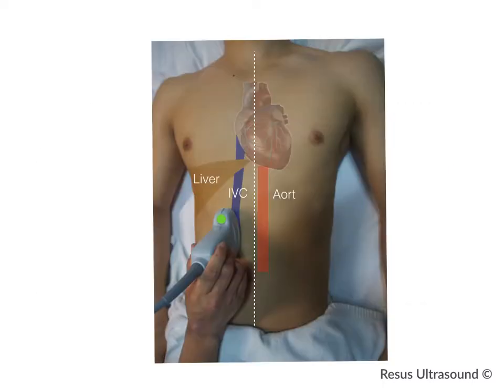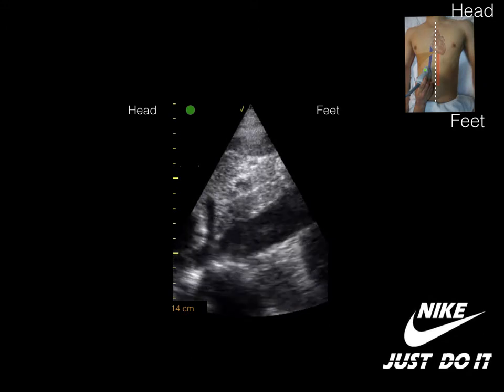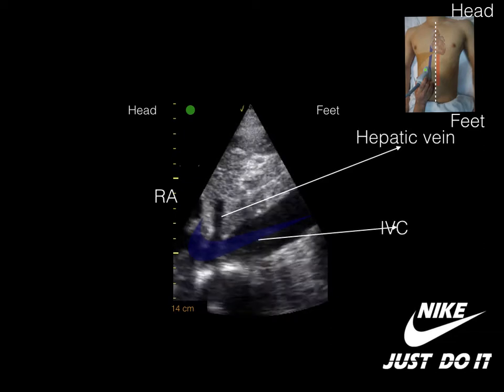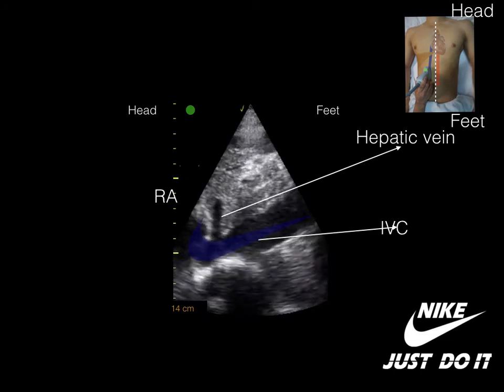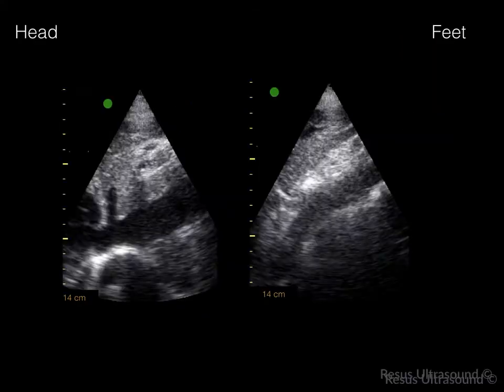And it's leaking. To do IVC ultrasound, put your abdominal or echo probe a little bit to the right of the midline of the patient. The marker should be toward the patient's head, as shown in the green circle here. You will see a black tube which varies by respiration — a swoosh up, or it looks like a checkmark or a Nike logo — this is the IVC. There is also a hepatic vein draining in.